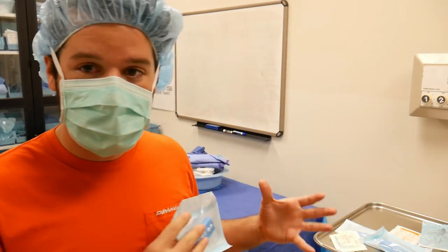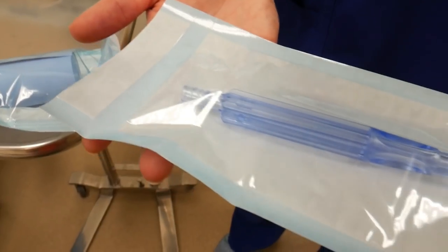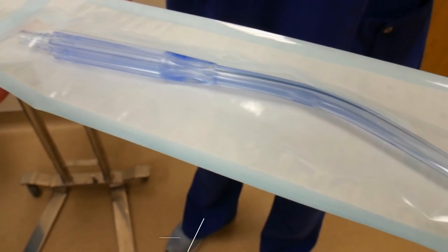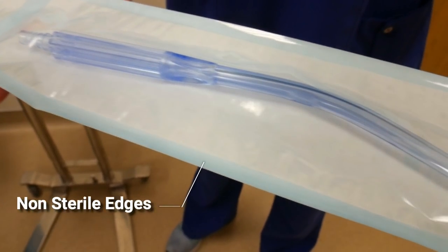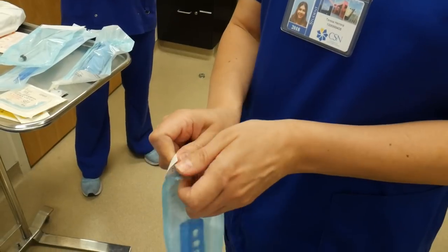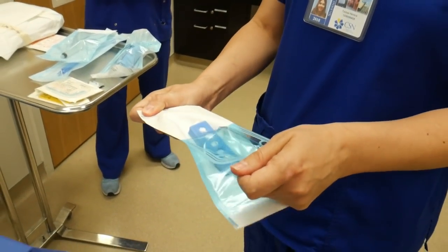Before we start opening anything up, I want to just break down the actual package itself. Some important things to note are these sealed edges around the wrapper of the peel pack — those are considered non-sterile when you're opening up the package. As you're opening up the package as well, the edges of the wrapper are initially considered contaminated around two inches of diameter.